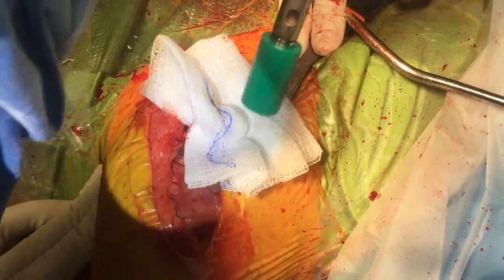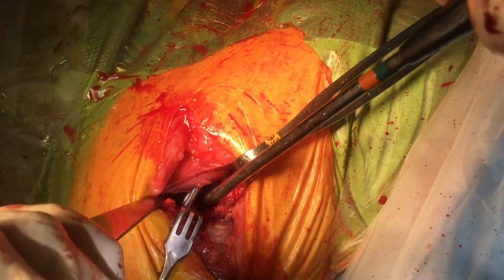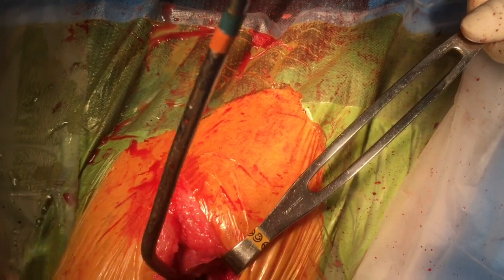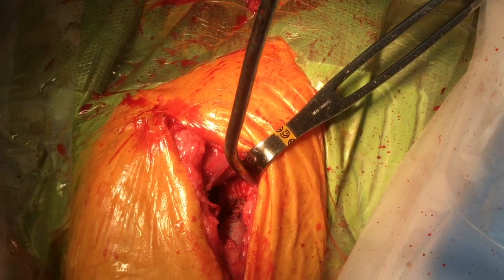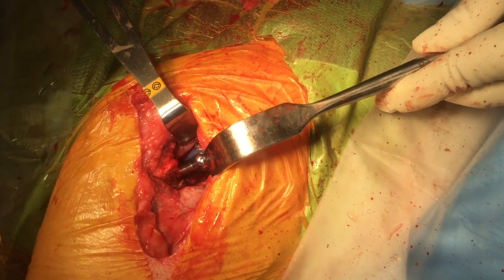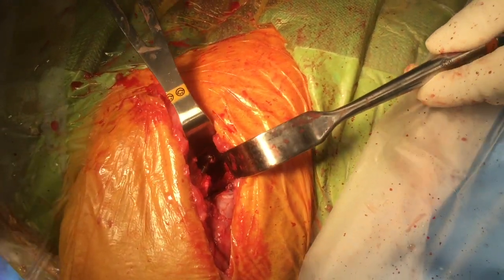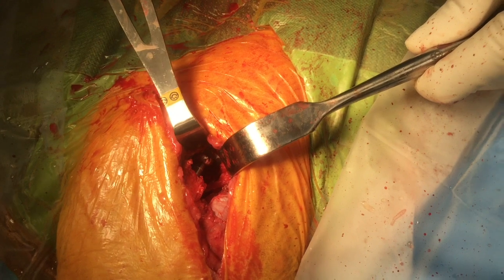The final head is applied to the neck of the stem and reduction is performed using a retractor at the trochanter and a Hohmann retractor caudal to the acetabulum, levering the head into place while traction is applied to the limb. Position is checked particularly in extension and external rotation, and tension is assessed by placing traction on the femur.